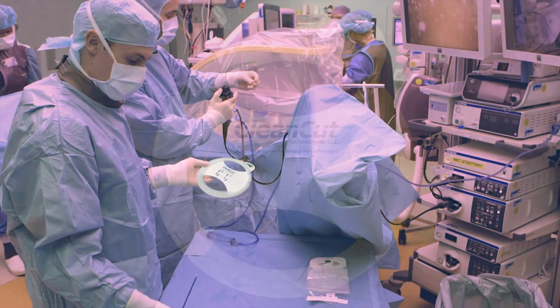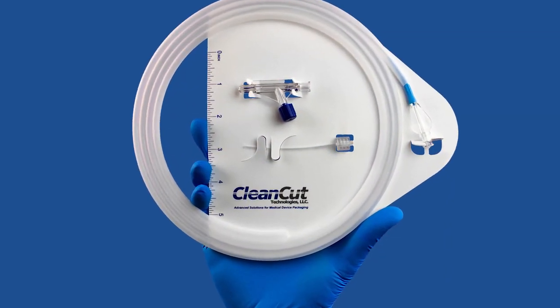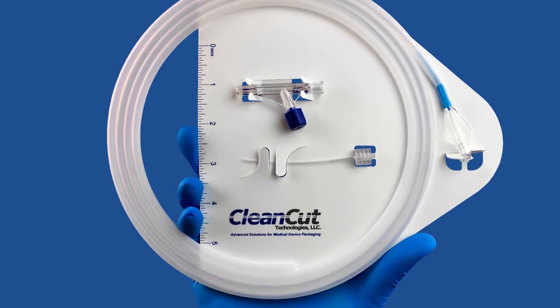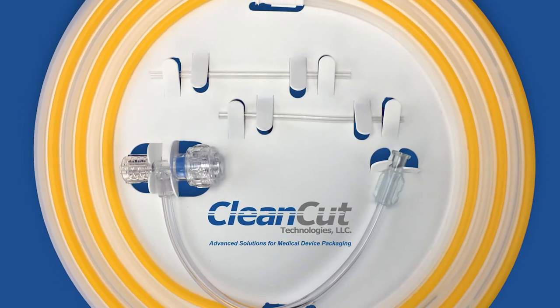While medical device manufacturers are impressed with the reduced packaging and cost savings the DISC offers, surgical teams find it exceptionally easy and efficient to use in the operating room. Providing multiple components in just one convenient package reduces the prep time necessary for medical professionals to open and assemble various components.